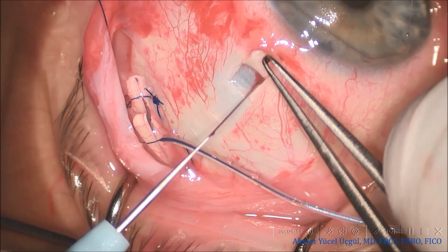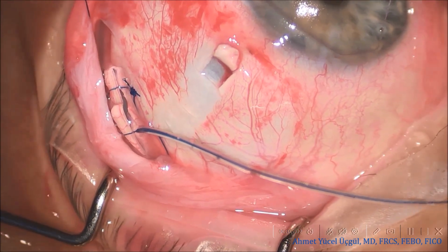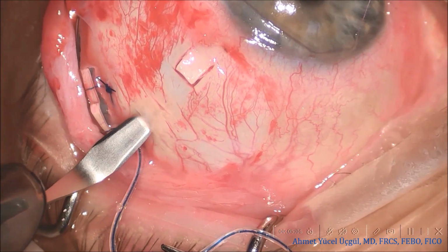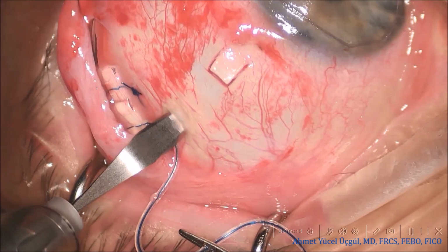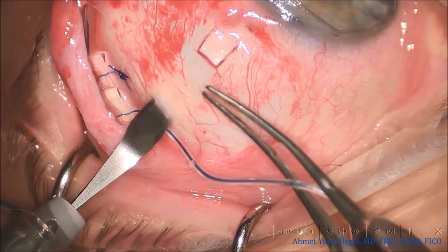The main purpose of this flap is to cover the tube, thereby helping to prevent early post-operative peritubular leakage and reducing the risk of late tube erosion. At this stage, a two-step scleral tunnel is created with a crescent blade, again at approximately 80% scleral depth. Two points are particularly critical here.